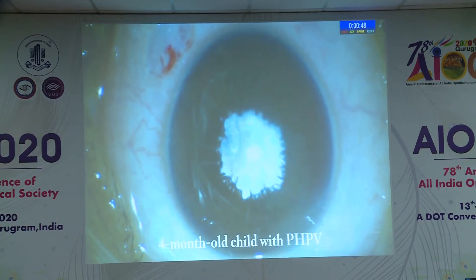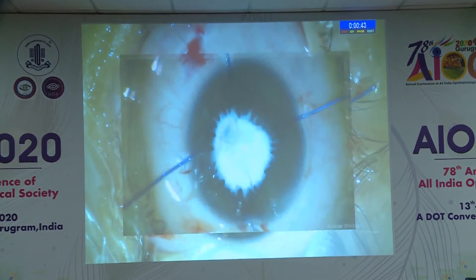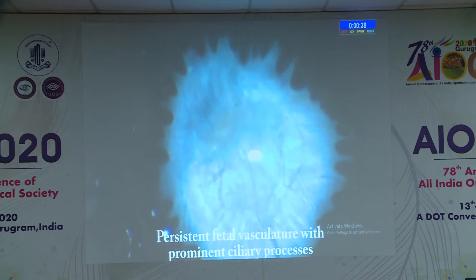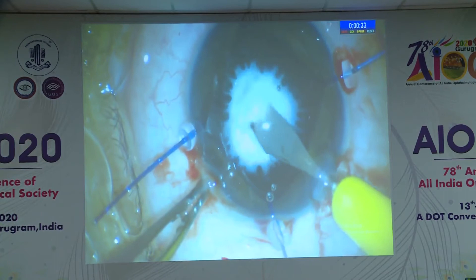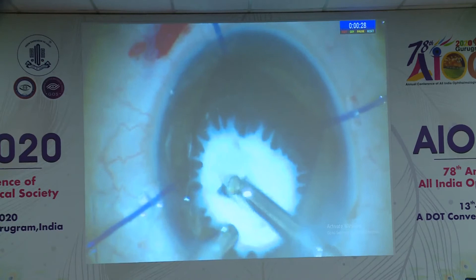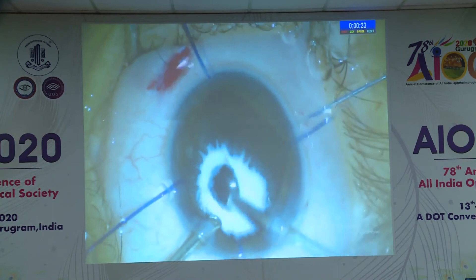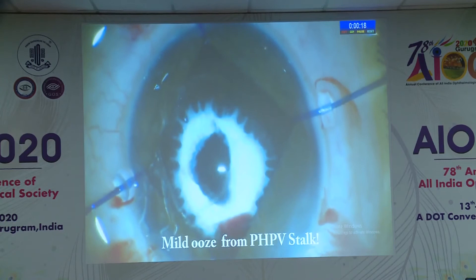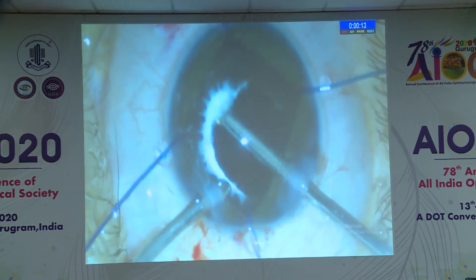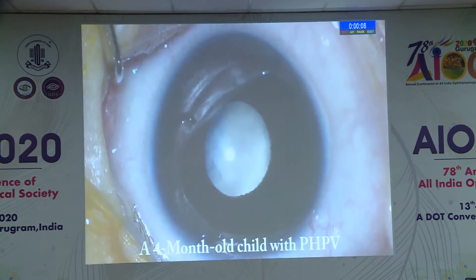This patient has PHPV - this was done more than 10 years back, a complex situation where a vascularized membrane was present. It is very difficult to cut this posterior capsule so you have to make a nick in the posterior capsule and do capsulotomy. If there is any stalk you have to do cauterization. There was a bleed in this case because cauterization was not done initially, and no IOL was implanted in this child.